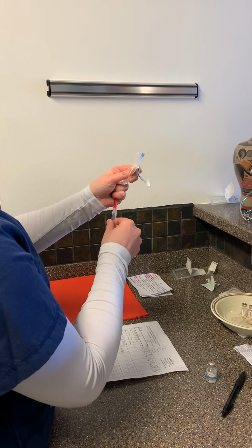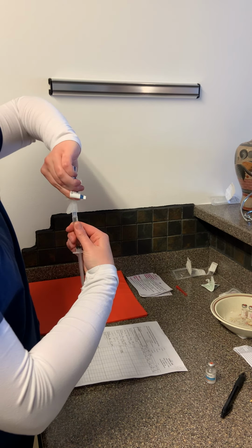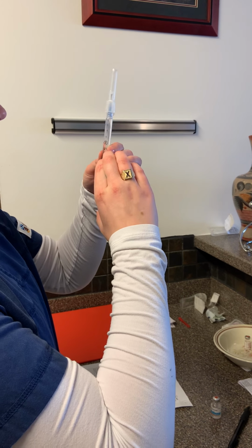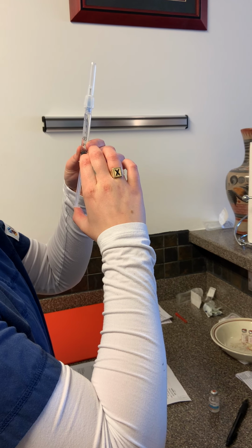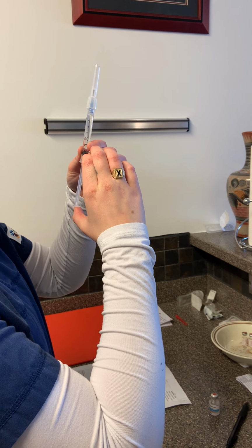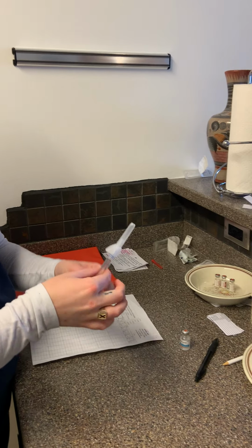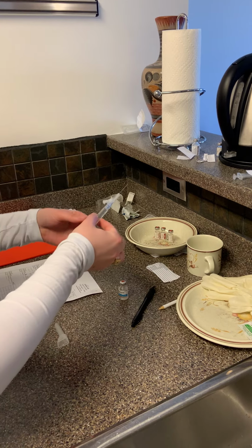So I'm going to throw the blunt fill in the sharps container, and then I'll attach my IM needle, throw that in the garbage. And then I will calibrate to the correct dose, making sure there's no bubbles, and I'm just watching for a bleb at the top, which there is one. So now I'm going to take the cap off and waste the rest in the med waste bin.